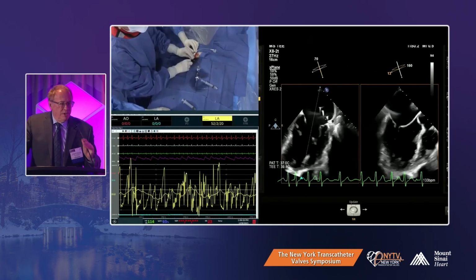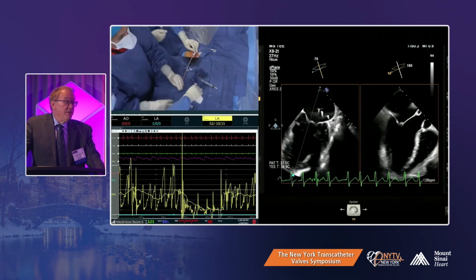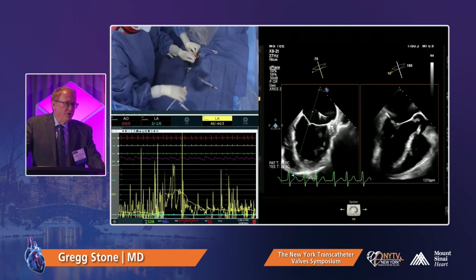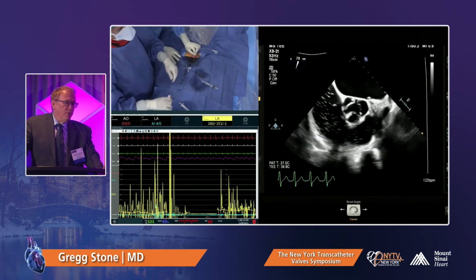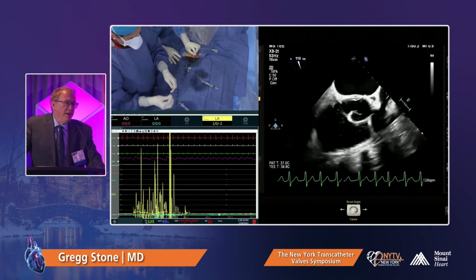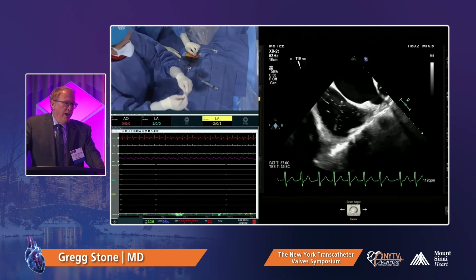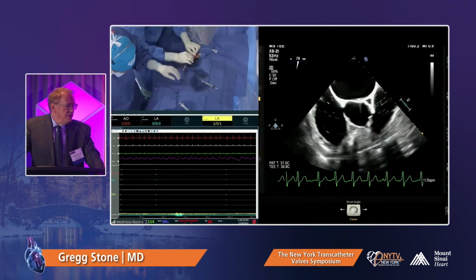Yeah, so this would have been a very good patient for the COAPT trial. We took patients with either ischemic or idiopathic dilated cardiomyopathy who were either good surgical candidates or very poor surgical candidates, so surgical risk didn't factor into it, who had either 3+ or 4+ mitral regurgitation. There were a variety of ways that we determined that, but the easiest way to remember is either an EROA of greater than or equal to 0.3 square centimeters or a pulmonary systolic venous flow reversal. That was about 87% of the patients in COAPT.